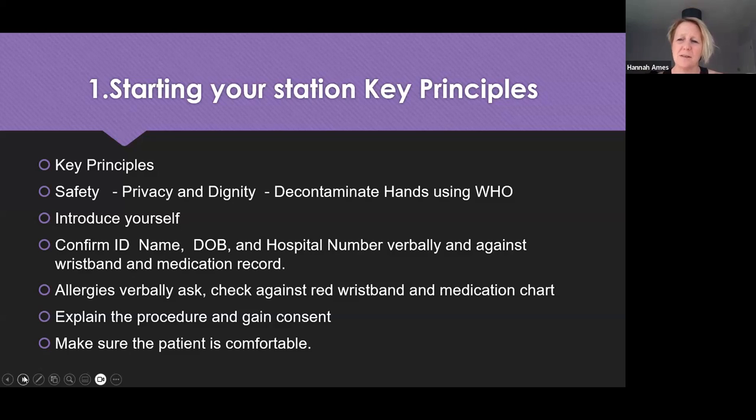I'm going to explain that we're going to put a mask onto the face. It can be a little bit tight. We're going to give some high flow oxygen. It's going to help with your breathing and increase your oxygen levels. I'm going to say a couple of the side effects so the patient can make informed consent, okay? So it can make you feel a little bit lightheaded. It will dry your mouth out, but we'll make sure we give you regular mouth care, okay? Can I check the patient is comfortable before I move on and that I've got consent?